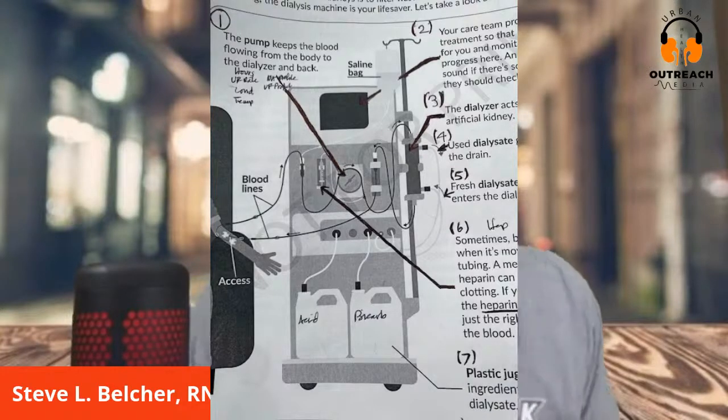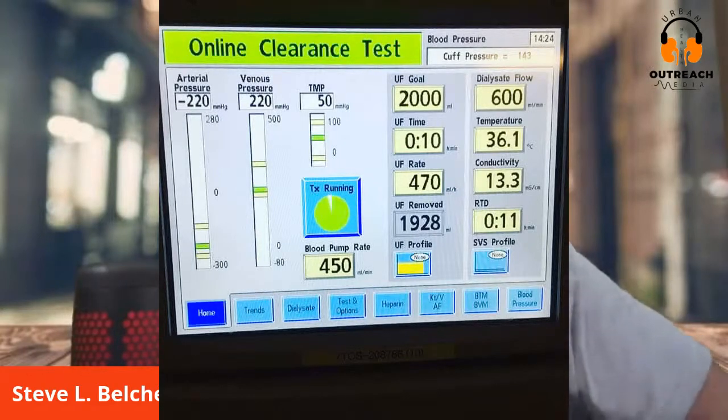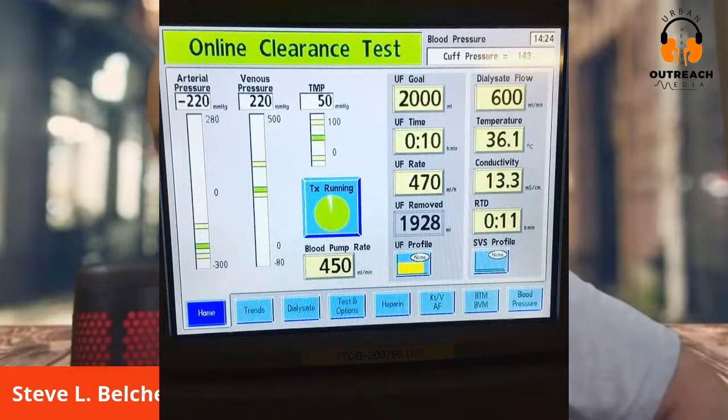You see that screen right there, that black screen that it's pointing to? Let's talk about this. Your tech or your nurse programs your treatment right into here. At the top where it says UF goal, that's 2,000 milliliters, or 2 liters. If you want to go by pounds, multiply by 2.2. The point is, that's the amount of fluid they're going to remove.